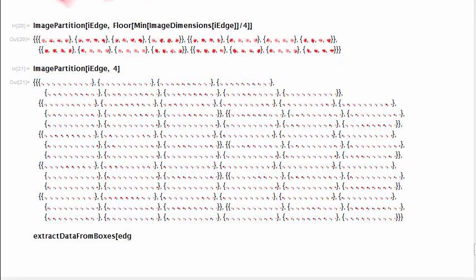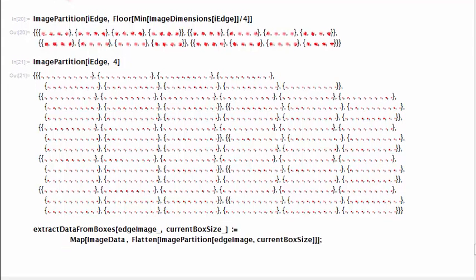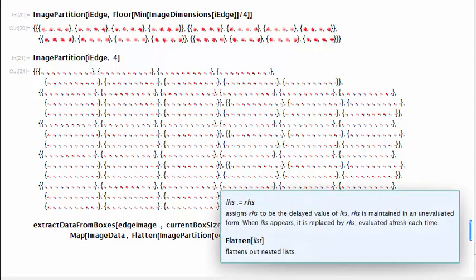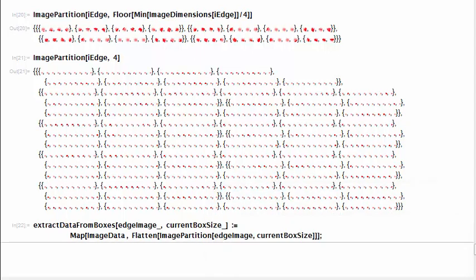We define this utility function, extract data from boxes, that will divide the edge image of the volume in a defined box size. Inside extract data from boxes, we use Flatten to convert the list of lists output of cubes from image partition into a single list on which we will apply image data.